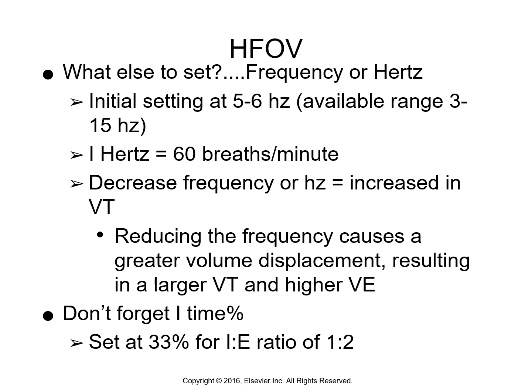So it just sounds kind of like a jackhammer when it's running. It's just like boop, boop, boop, boop. Don't laugh at me. I know you guys are, but whatever. And that's just kind of how it sounds. And it's like super fast. That's just the chest wiggling at that rate, and that is the hertz. Okay.